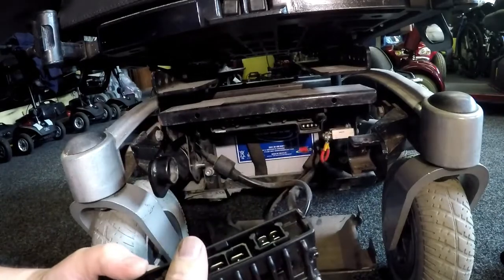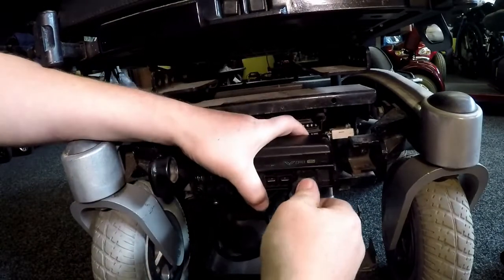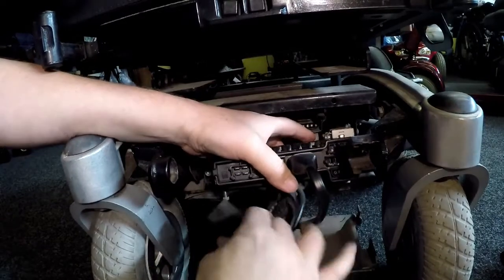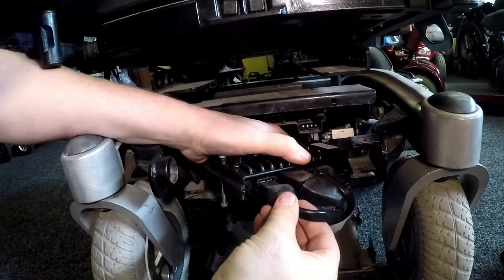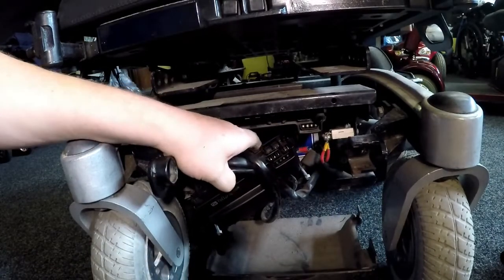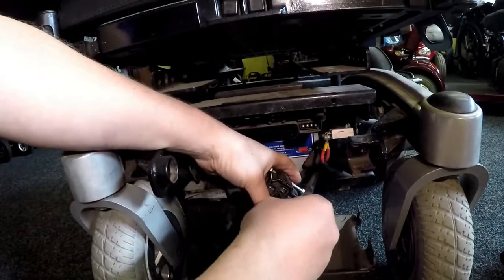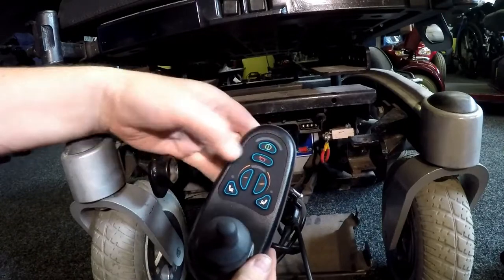But what I'm going to do with this one is plug everything into the power module. And it's upside down, so that's that way. Then you've got a left hand motor, you've got power, and you've got right hand motor. I've got it in drive. Yeah, let's see, I've got my extension. I'm going to plug in here. Now I'm going to switch it on, see what happens.